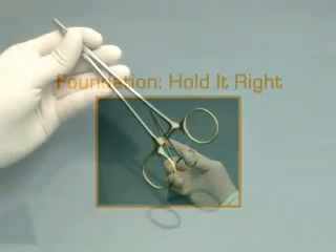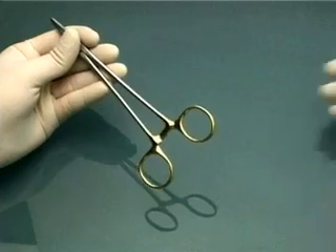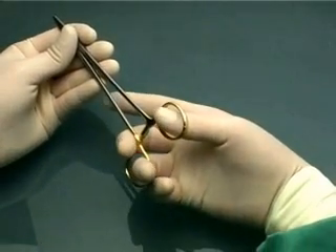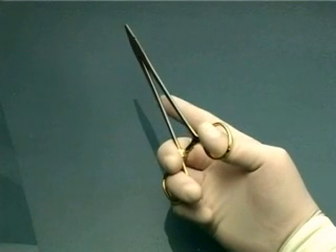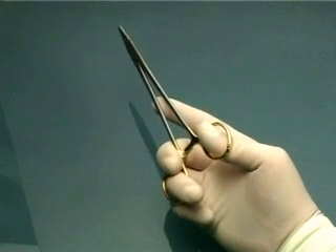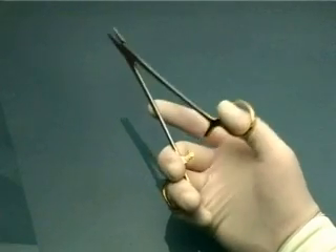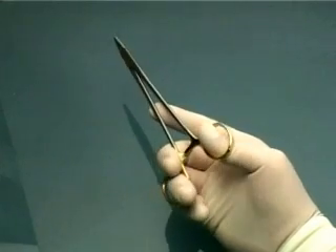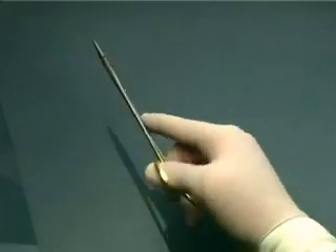The needle holder is a ring instrument. The way to hold it is to put your thumb and ring finger through the rings. Your middle finger and index fingers serve to steady the instrument. For beginners, you will find that it is easier to release the ratchet mechanism of the needle holder this way. However, you may find a slight restriction in the rotatory movement of the needle holder when you suture.